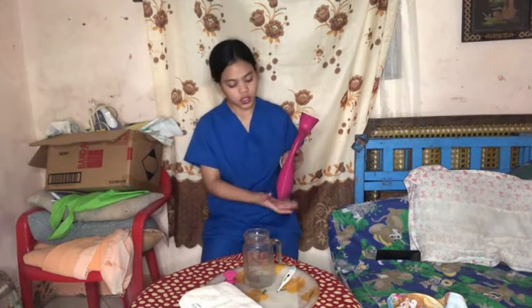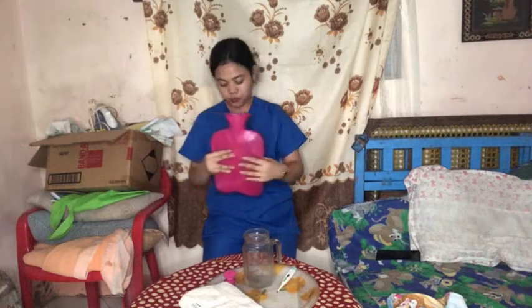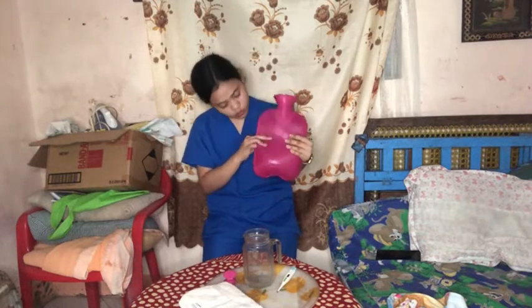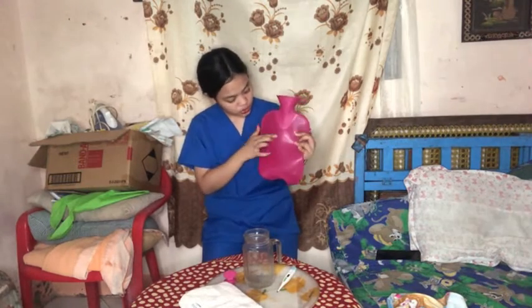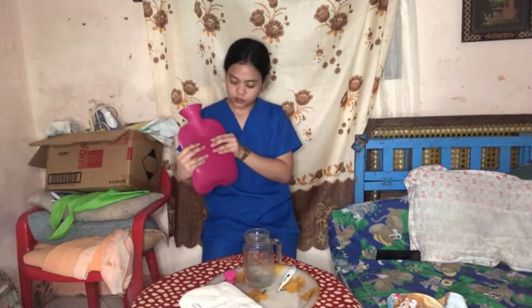So this is how we fill the water to 2/3 full. It's just at this point. As you can see, it is only in the middle half.